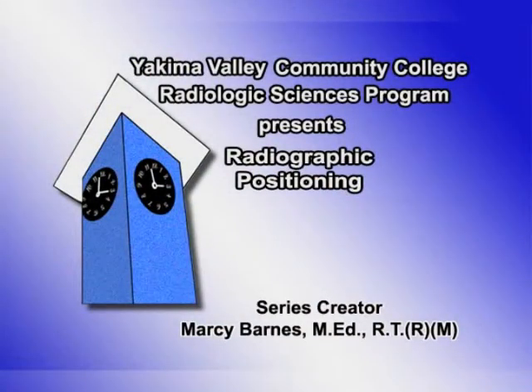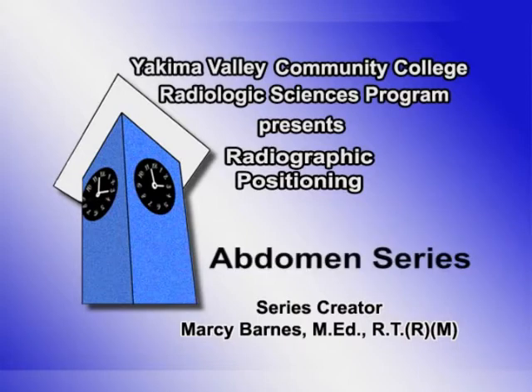Yakima Valley Community College Radiologic Sciences Program presents Radiographic Positioning Abdomen Series. We're going to have some discussion on the abdomen series before we actually go position our patient for it.